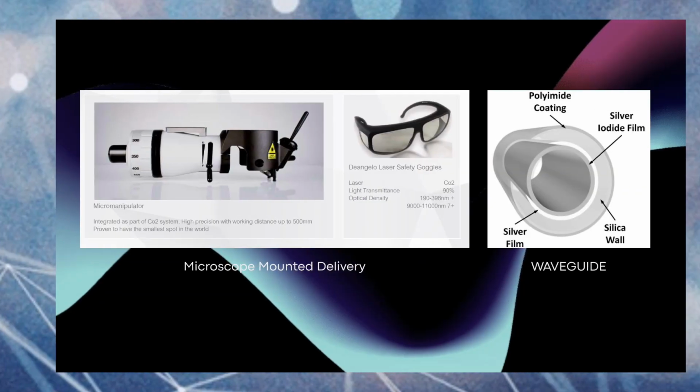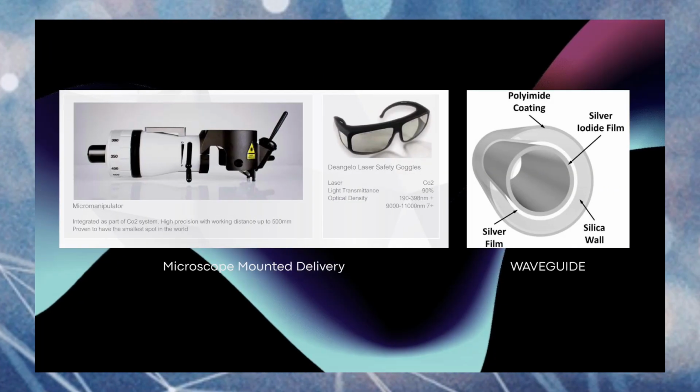Now, the current available delivery systems for CO2 laser are either a micromanipulator mounted to the microscope or a handheld waveguide. Now, the micromanipulator, it goes through the air. So the CO2 energy is very easily going through the air. So this is also a risk because you can just shoot the laser through the air very easily and far.